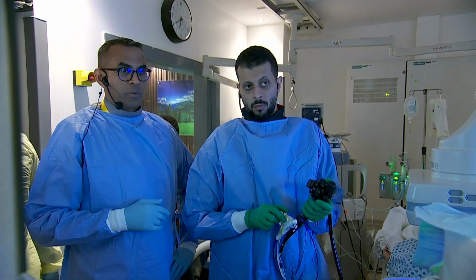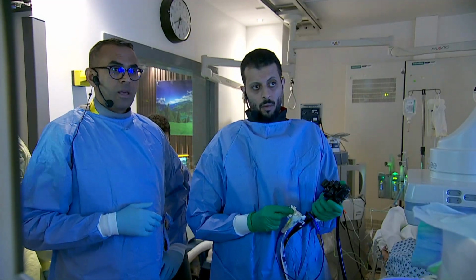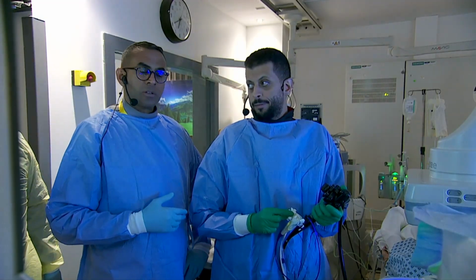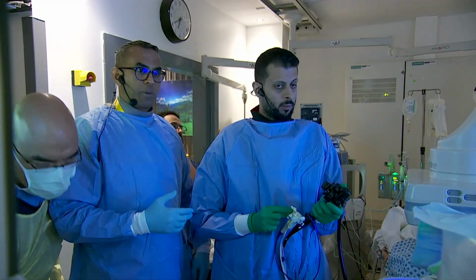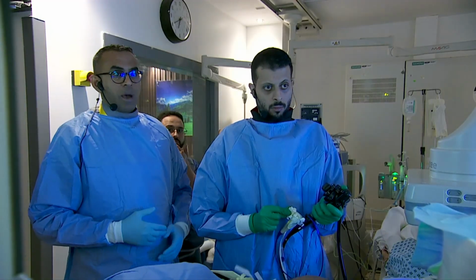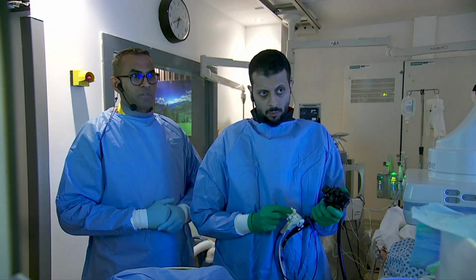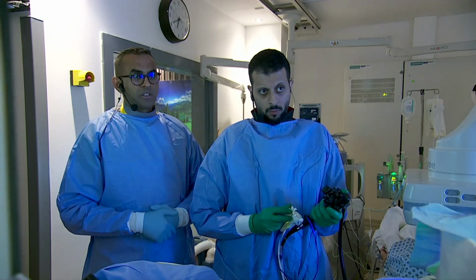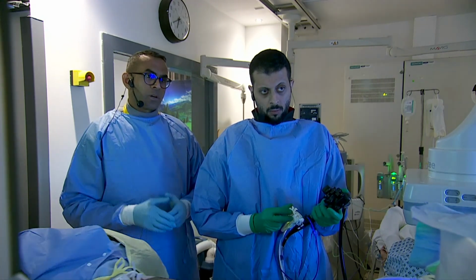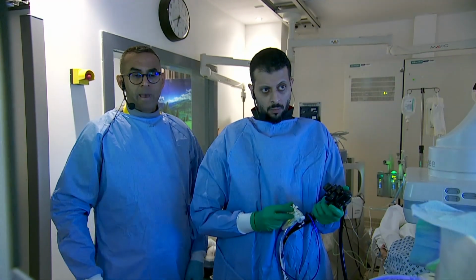One of the challenges that we are facing is indeterminate strictures, meaning that we don't know exactly the pathology behind the cause of the stricture. Here cholangioscopy comes to play a major role in determining the possible features that could be seen to help diagnose whether this is favoring a benign or malignant stricture. And then comes the advantage of having a cholangioscope to offer a direct tissue biopsy, that means tissue biopsies under visualization, or at least to do some interventions.